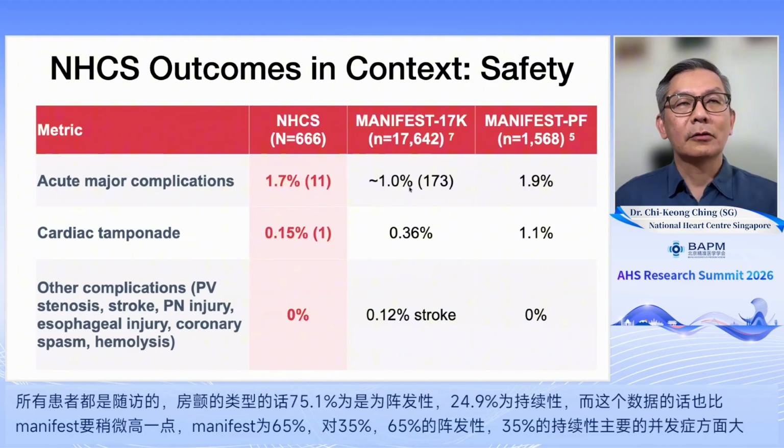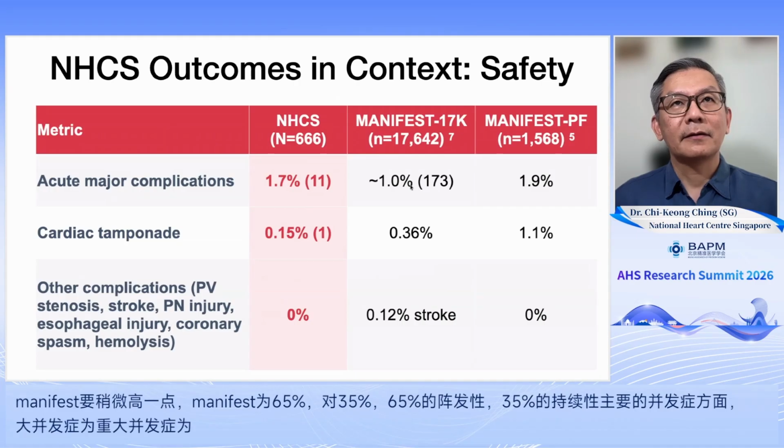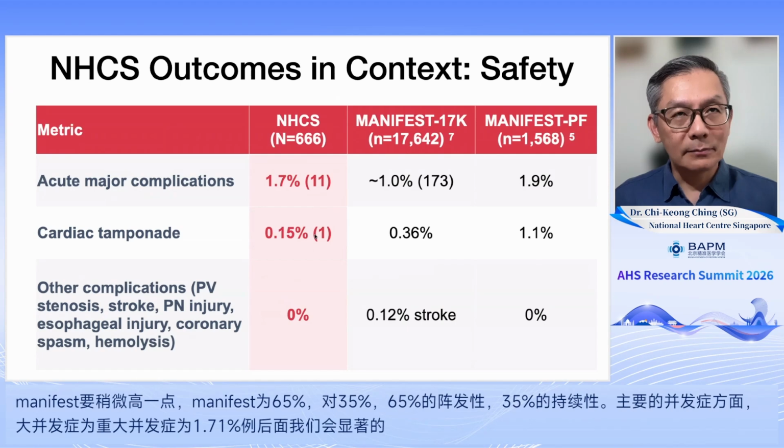A little higher compared to MANIFEST-17K. All right, cardiac tamponade occurred in 1 patient, 0.15%.